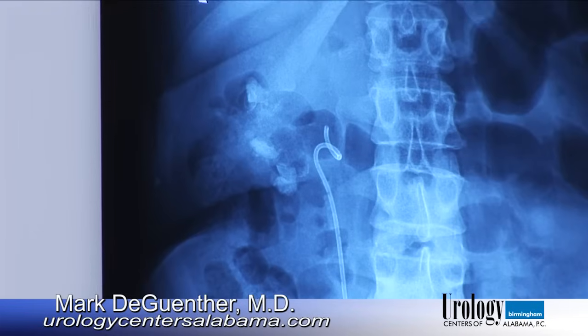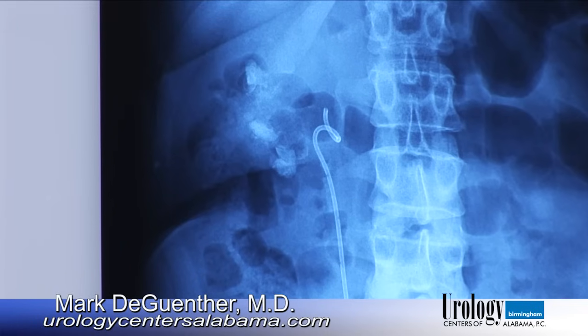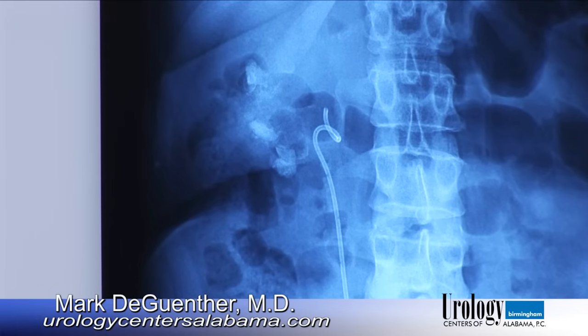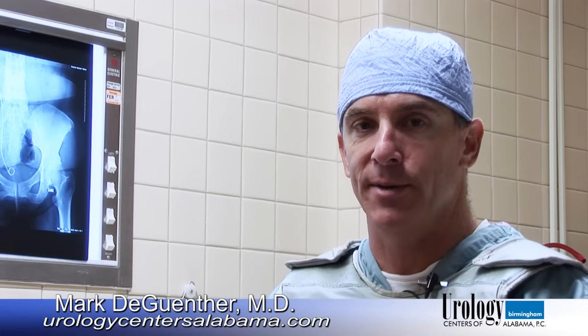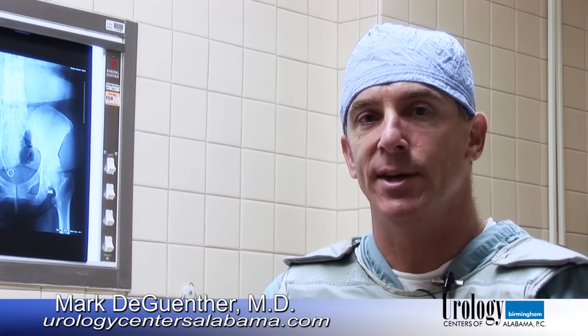Generally, if there is a large stone greater than about half an inch or so, we will need to place a stent. Otherwise, we can do this procedure without a stent. The stent offers a measure of protection for the patient against having a stone fragment block them up.